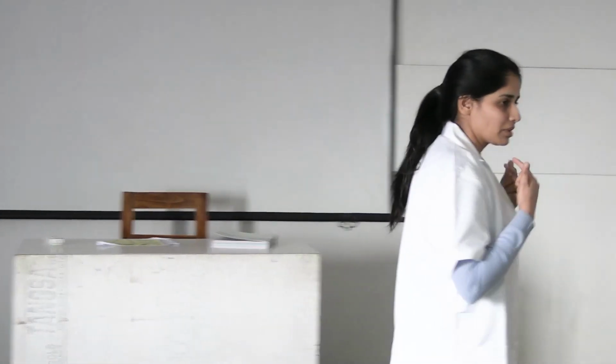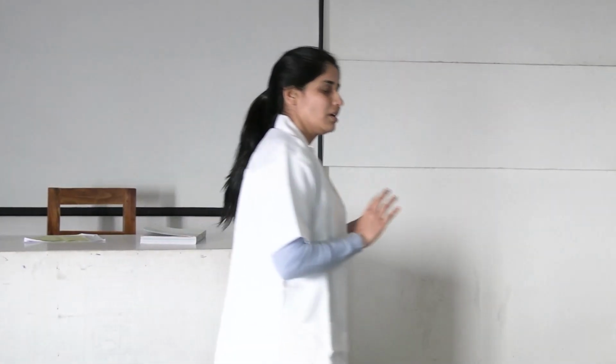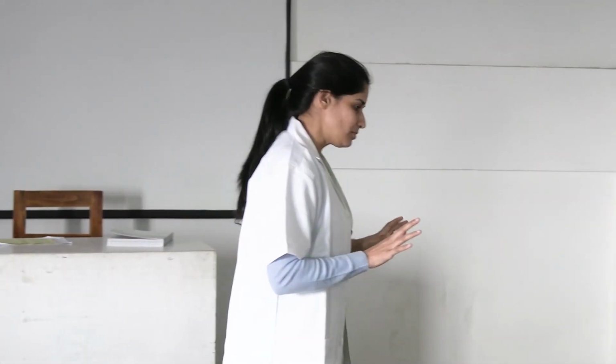So there is a multi-lumen catheter which you can use in the patient through a single line. If there are so many products to give, medications, blood, TPN, etc., it's not possible to insert too many peripheral lines at a time. Okay? This much you understood? Any questions about this now?